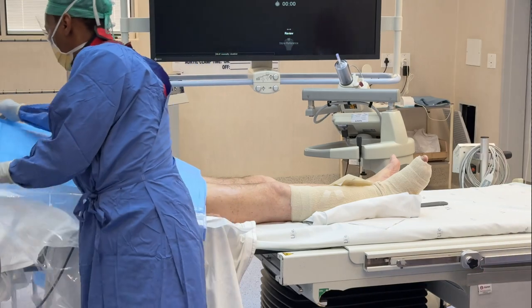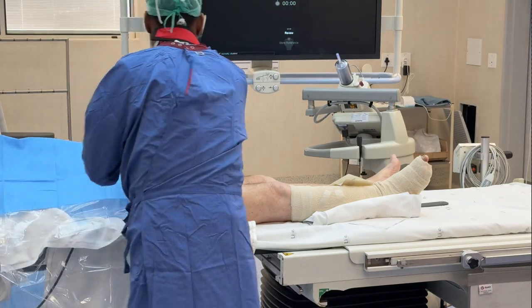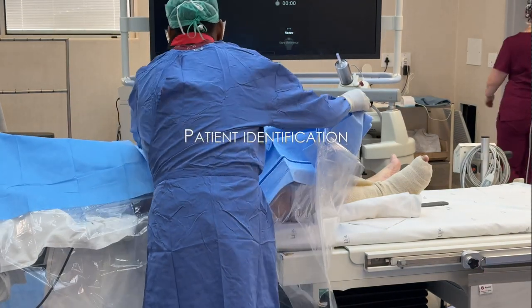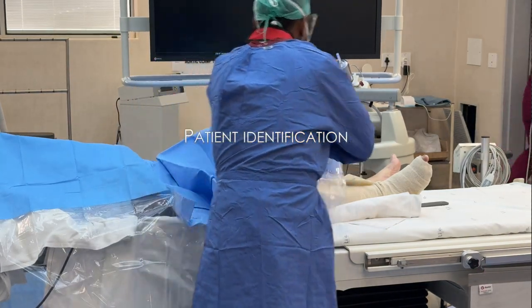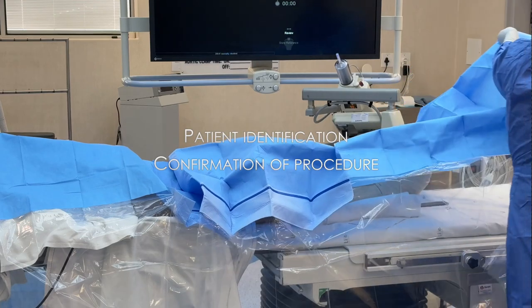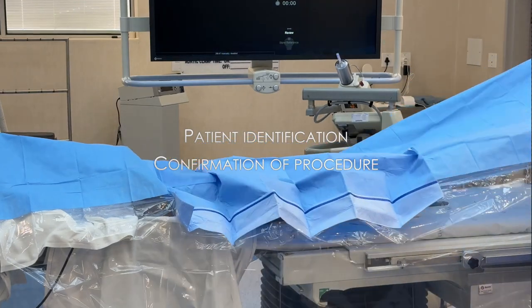On arrival of the patient in theater, the patient is identified and the procedure planned on the patient is confirmed.